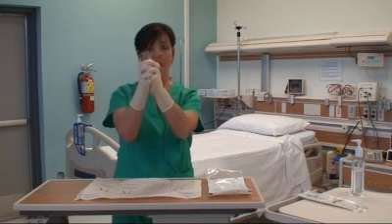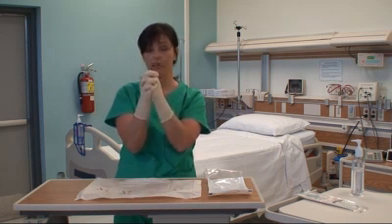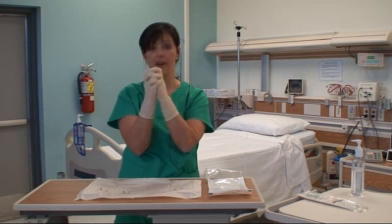Now I have donned my gloves, and my hands must remain above my waist. A good practice is to keep your hands together so that you don't accidentally contaminate them until you're ready to use them.